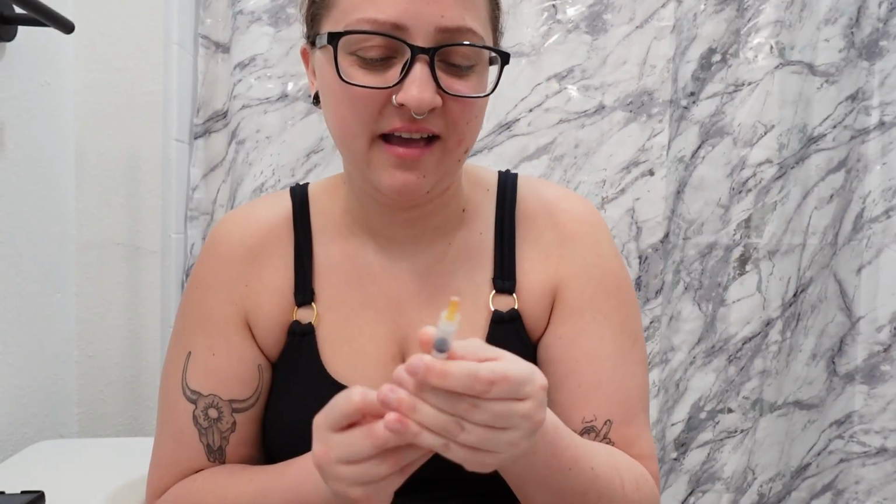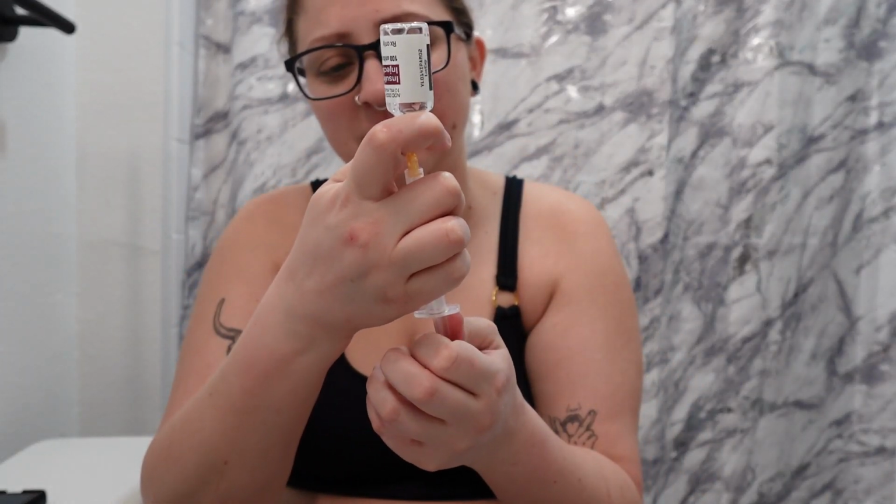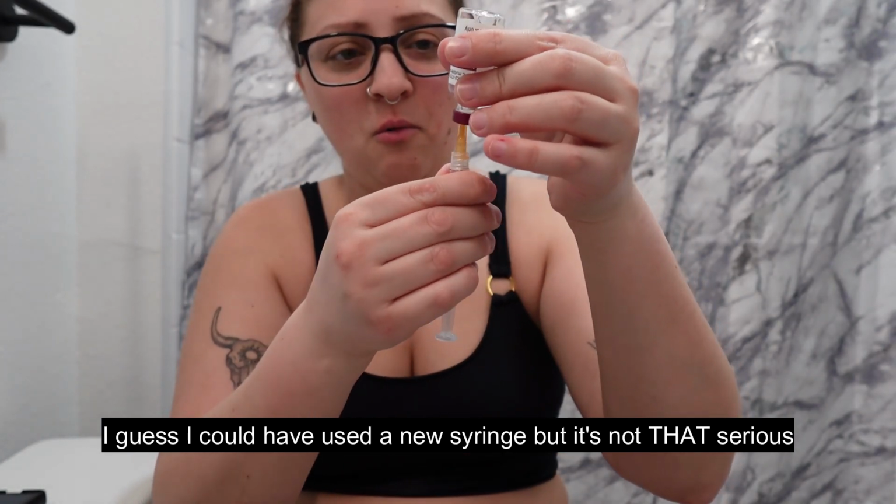So what I'm gonna do is pull out about 50 units from here, put it into here, and then whatever's left over, I'll just not put it back into the new one. I'll just put it into the old one. But I have a feeling that's about 50 units that I'm missing. I could be wrong, but we're gonna go with it. So I'm just cleaning it out. Not really. Guys, I don't really know what to do when you switch vials, because nobody really talks about it, it's just not really known what to do.